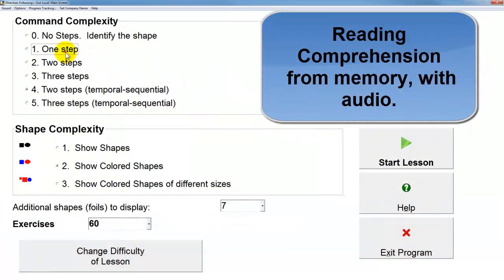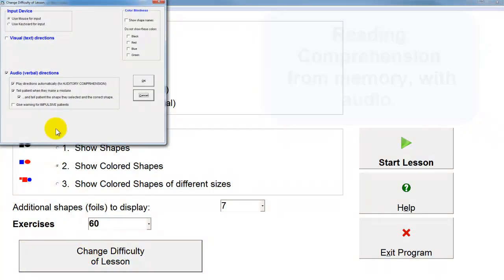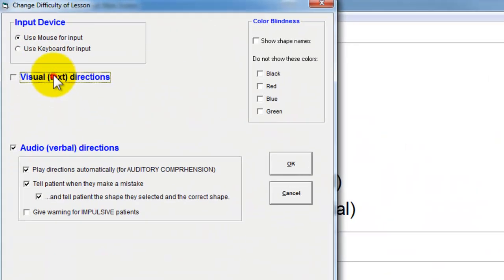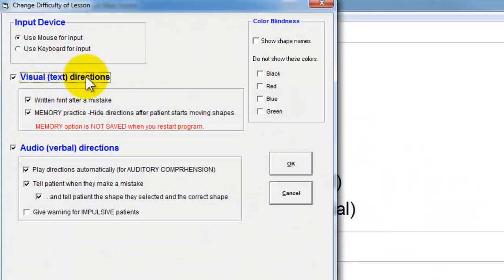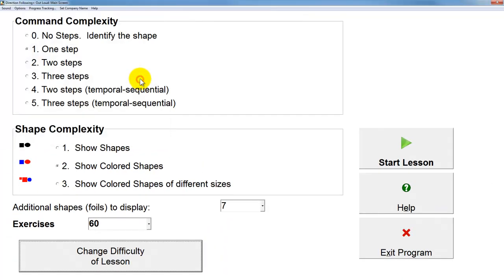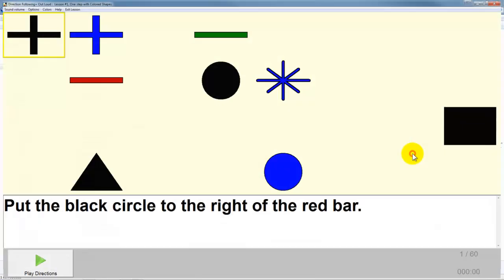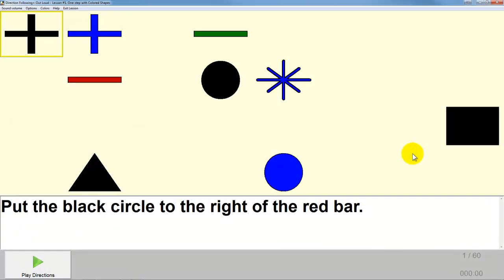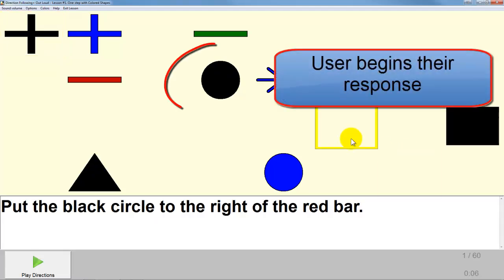Now we'll take a look at a reading comprehension exercise working on memory, so the patient will hear the instruction and read it, but then have to execute it from memory. Put the black circle to the right of the red bar.